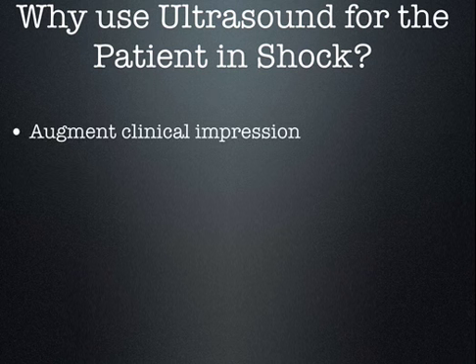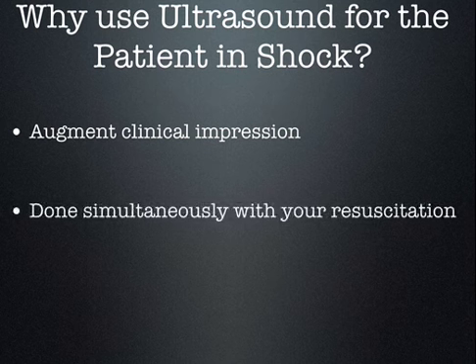So why use ultrasound? Well, it's going to augment your clinical impression. I'm not saying replace your clinical impression. Clinical impression still reigns supreme. Ultrasound is going to augment that. It's done simultaneously with your resuscitation at the bedside. I may be doing an ultrasound and taking a history and physical at the same time. I heard somebody mention delays, that it's easier just to get a gallbladder study in a radiology suite.